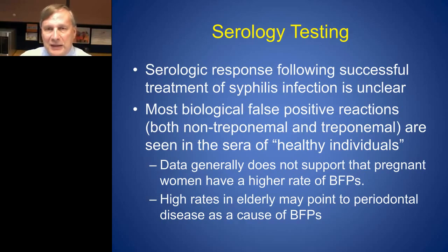And when I heard this, it caused the laboratories to start thinking a little bit and looking at this. While we used to see a lot of these biological false positives, the clinicians would say, well, I don't know why I sent this specimen in. Anyway, they'd say, well, if you don't want to know the answer, don't send it in to ask the question. And we deal with a lot of individuals that had these RPRs that were most likely false positives.